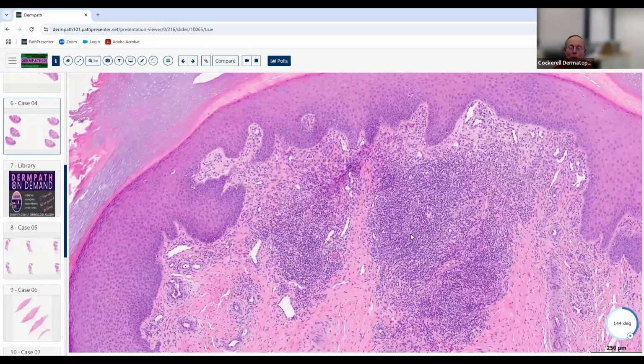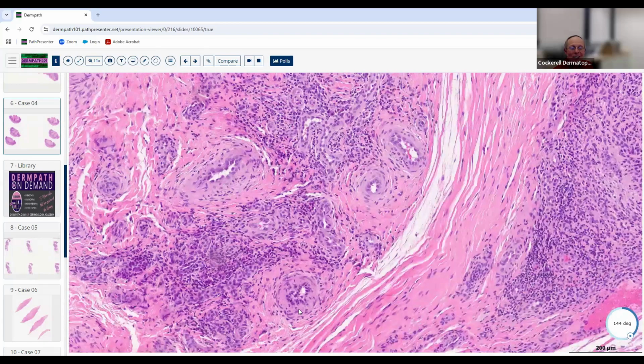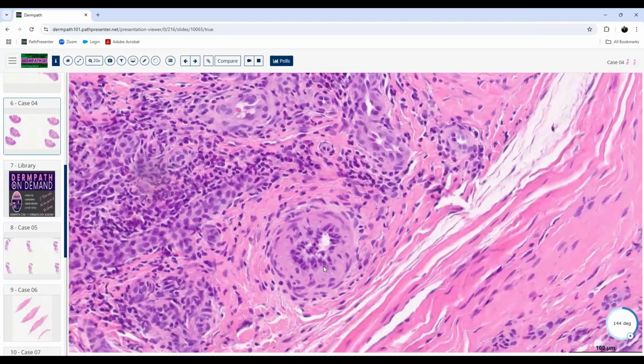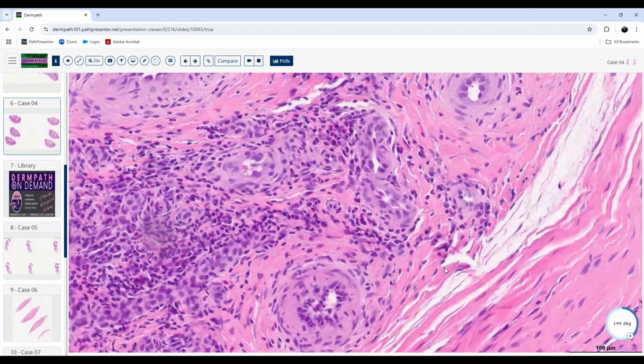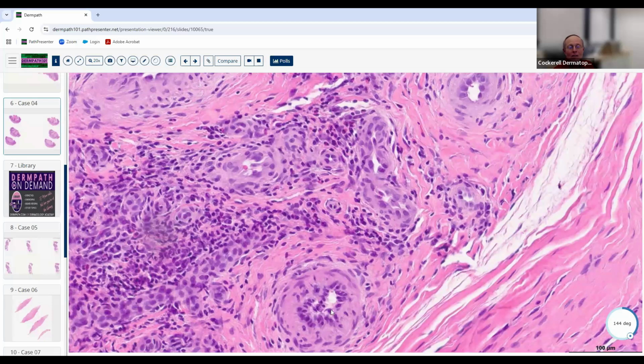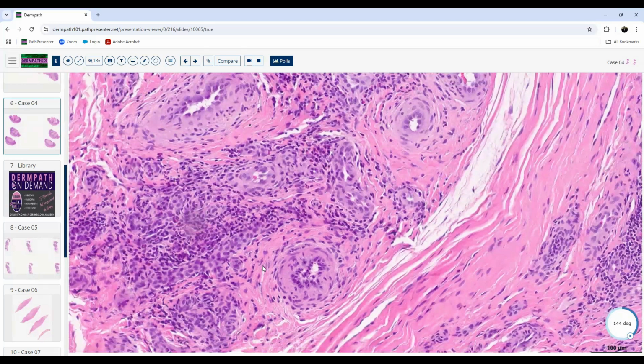Any final thoughts here before your diagnosis for our august audience? Those are the biggest things I saw. My differential, with the lobular distribution, was a lobular capillary hemangioma. What's the other name for that? Pyogenic granuloma. Is that your number one diagnosis? I would actually favor angiolymphoid hyperplasia, given the plump endothelial cells and the eosinophils as well. Good. And that's the right answer.